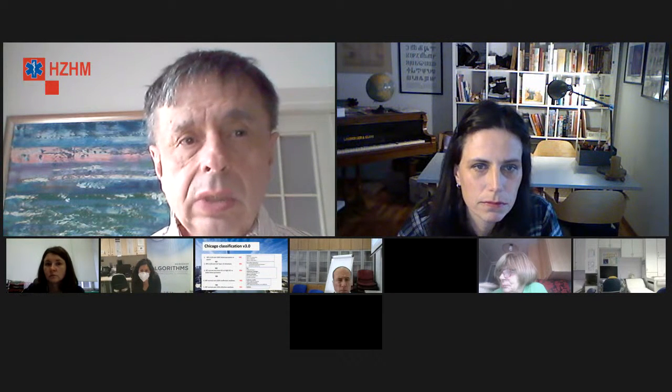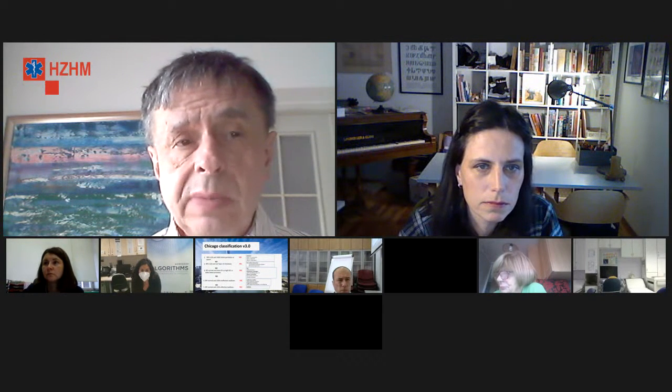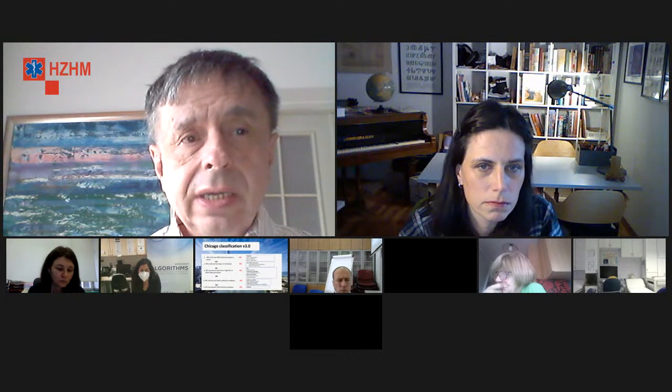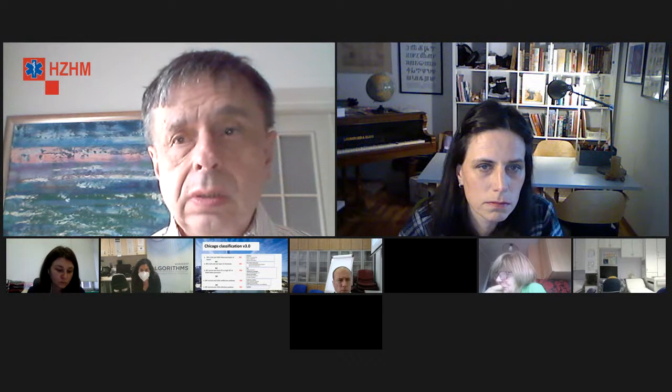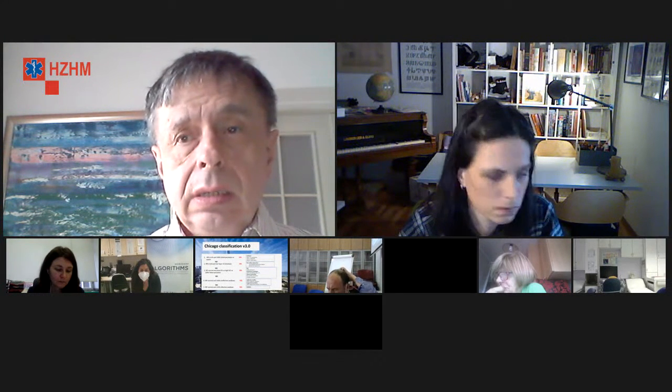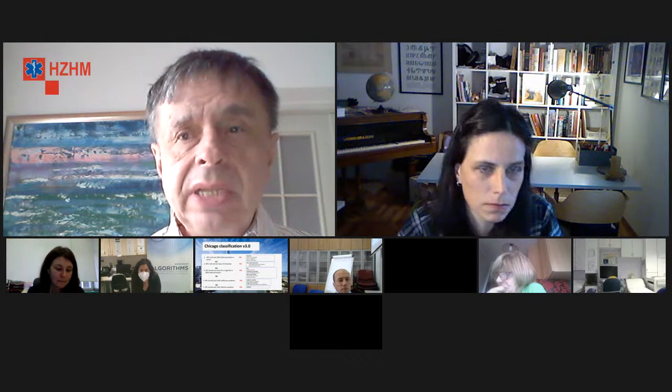Da, radio sam nekada na starom uređaju, a otkad je došla ova visokorezolucijska manometrija, to je nešto sasvim drugo. Ja sam tamo morao izračunavati visine, kuteve, dakle to je bilo poprilično mučno. Onaj ispis koji dobijete daje vam nekakve osnovne parametre, ali vi ste morali izračunavati kuteve, amplitude, visine, vidjeti je li to standardizirana vrijednost.